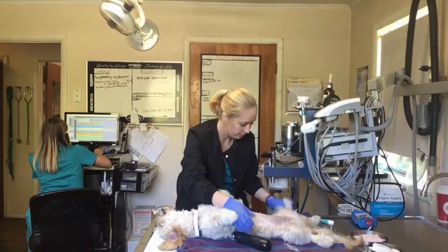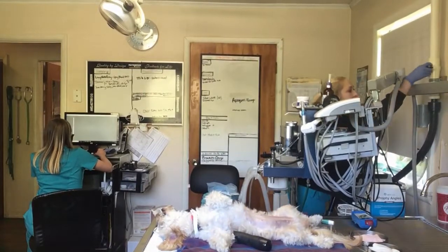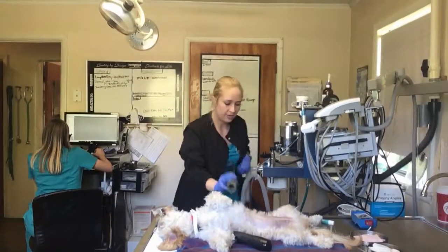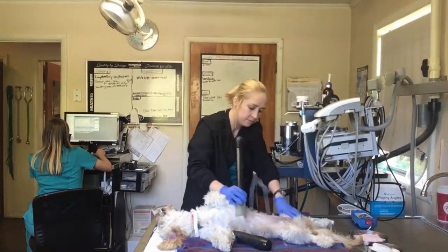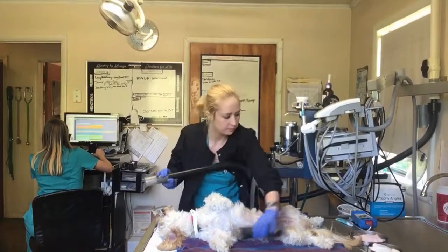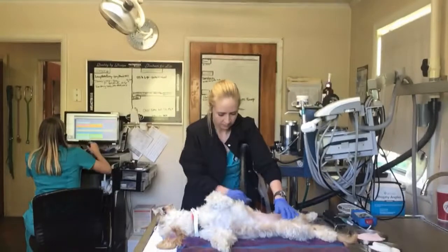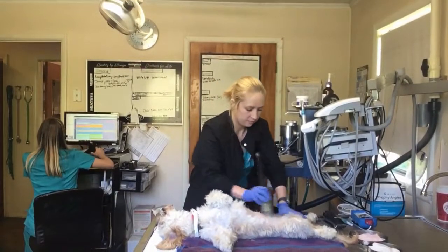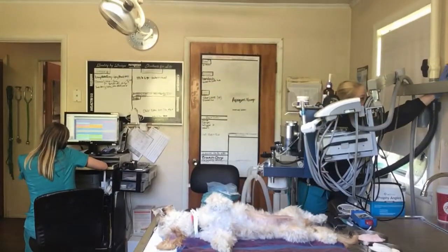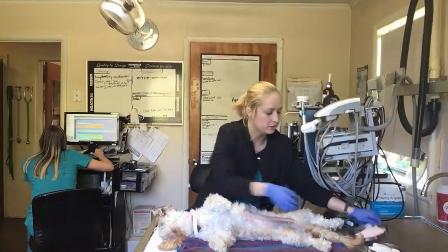Alright, now that I've got her clipped, I want to get rid of the excess hair. I'm going to go ahead and vacuum away the excess hair. Now that I've got her properly clipped, I can go ahead and start our scrub.